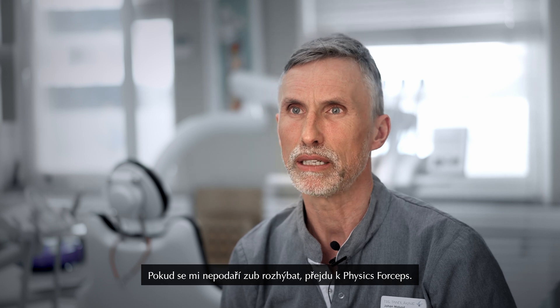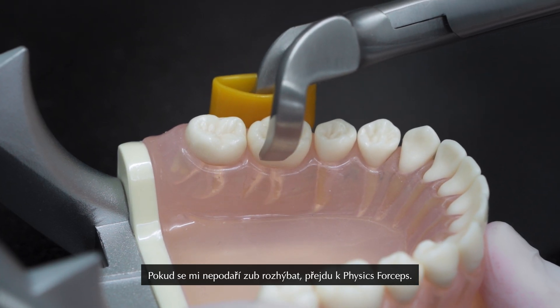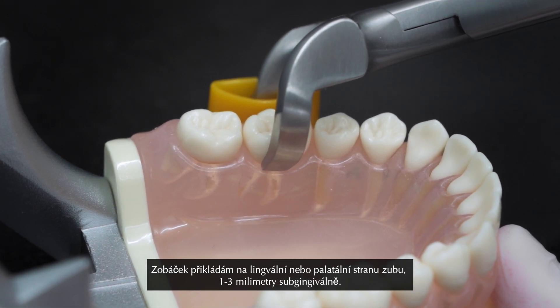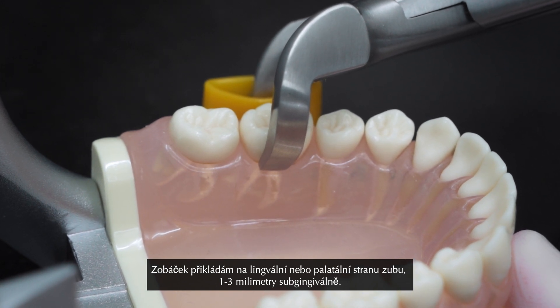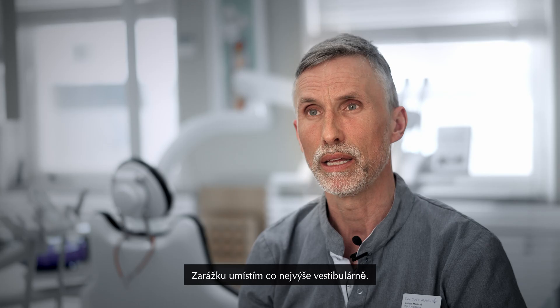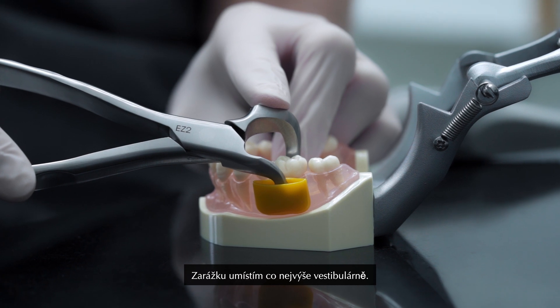If I don't get any mobility in the tooth I then go to the Physic forceps. I apply the beak on the lingual or the palatal side of the tooth, one, two, three millimeter sub-gingivally. The bumper I place as high up in the vestibulum as possible.